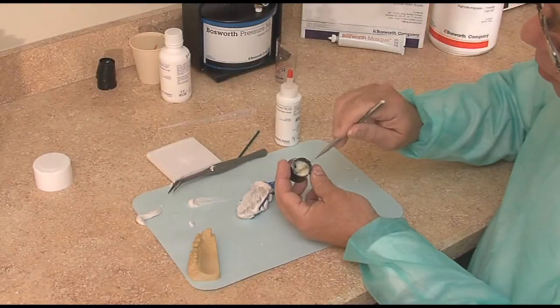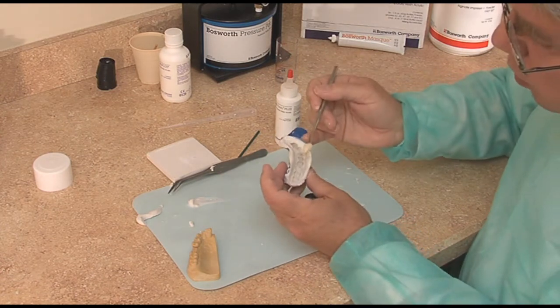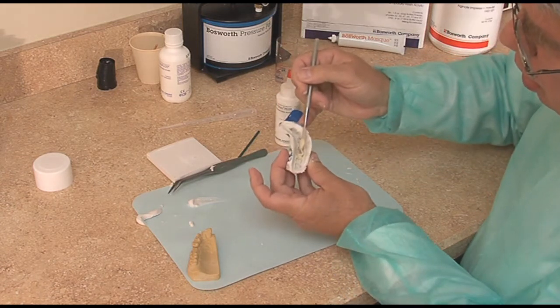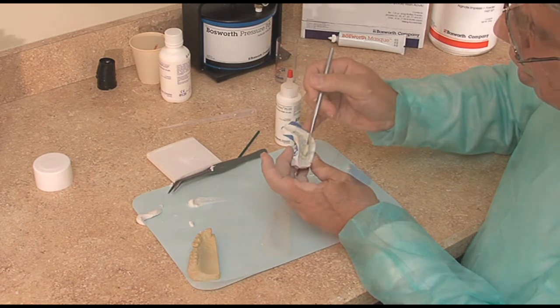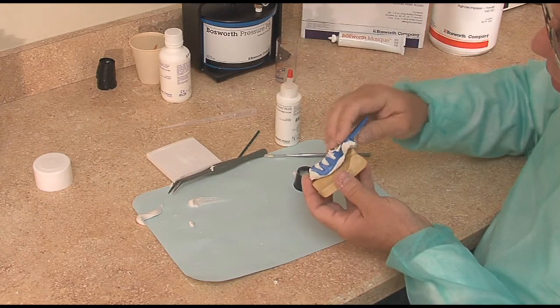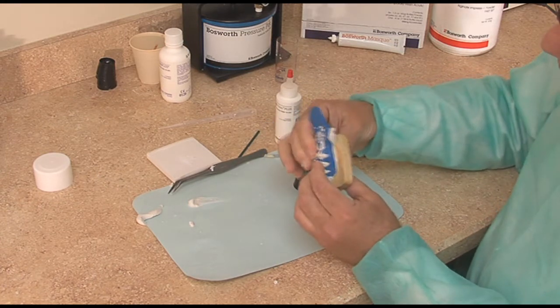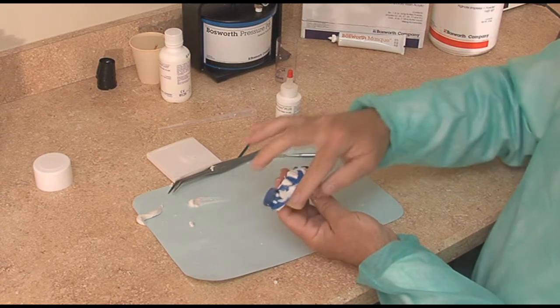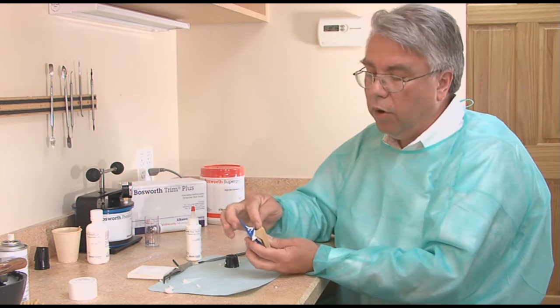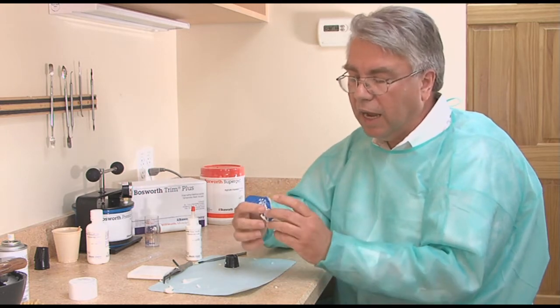I like to work it up from the bottom and try to get a nice dollop, and I gently just flow it into the area. I'm now going to place it right back in the patient's mouth, and with this opening here I can see where I'm going and how to line it up. If the alginate bulked all over you'd have no view on how to guide it in, so I like to keep part of it away from the prepared tooth so I can see past the lips and guide it in.